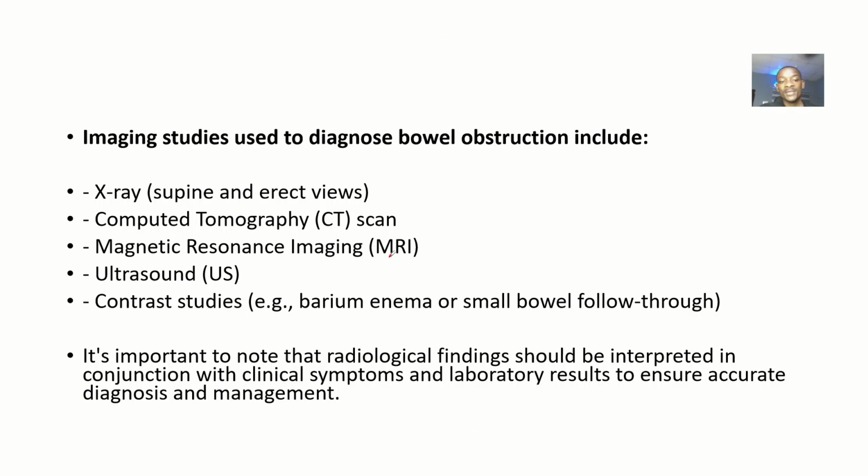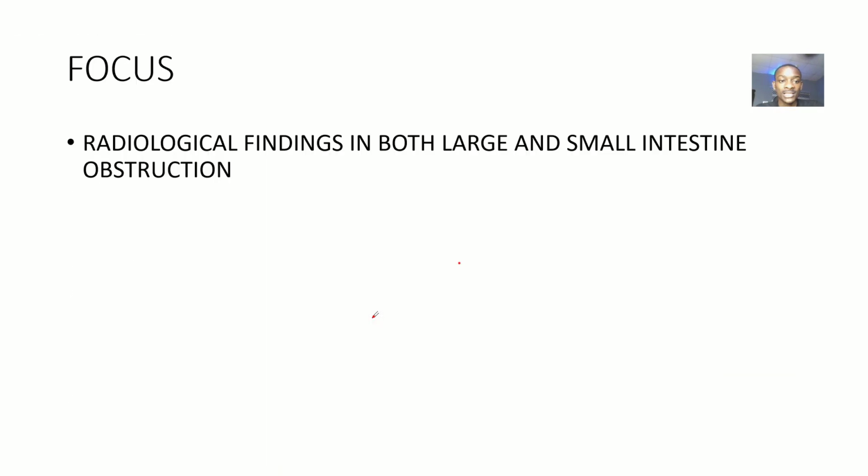Okay. So imaging studies used to diagnose small bowel obstruction include X-rays, computed tomography, magnetic resonance imaging, ultrasound, and contrast studies. All right. That's it about radiological findings in both small intestine and large intestine obstruction, or you could say bowel obstruction. So that's it.